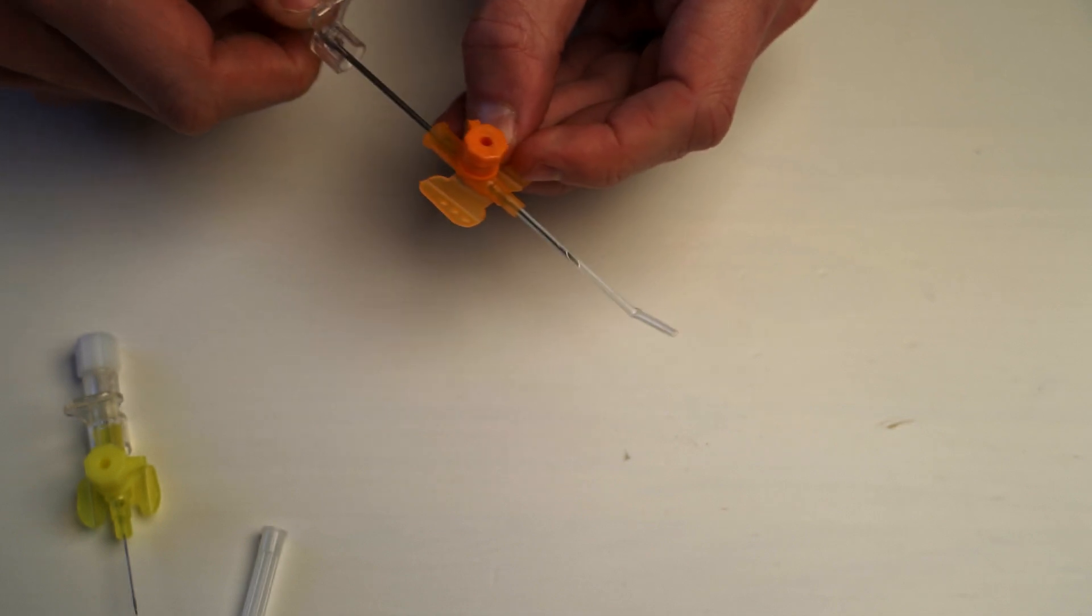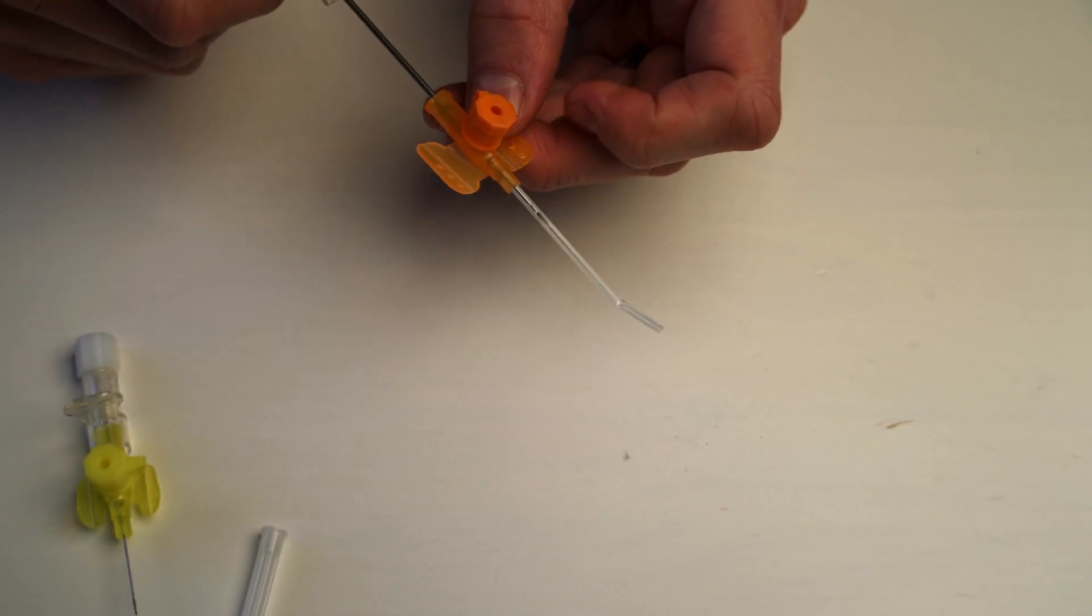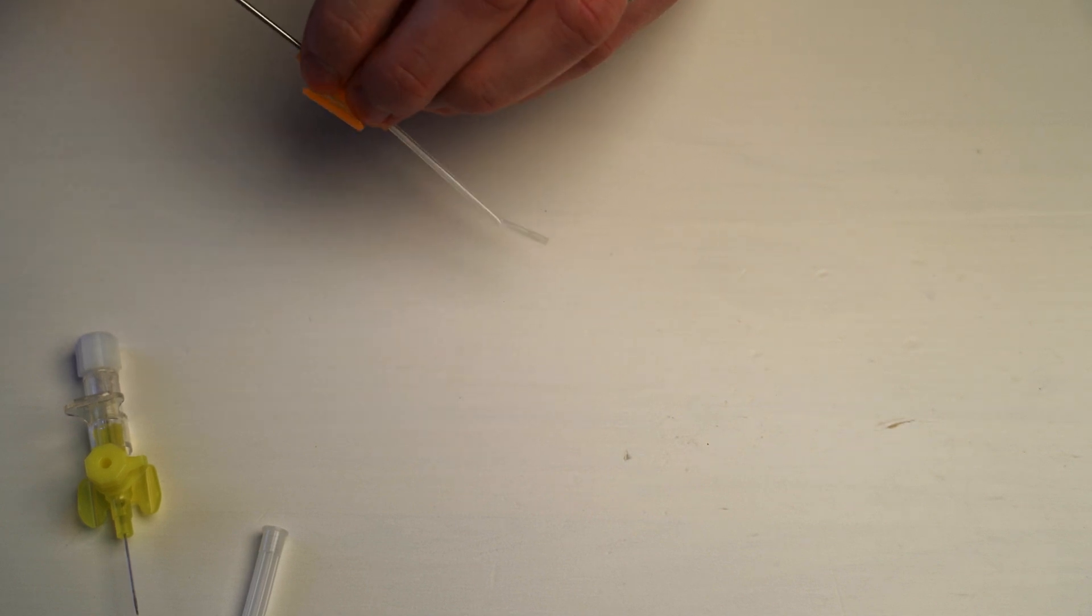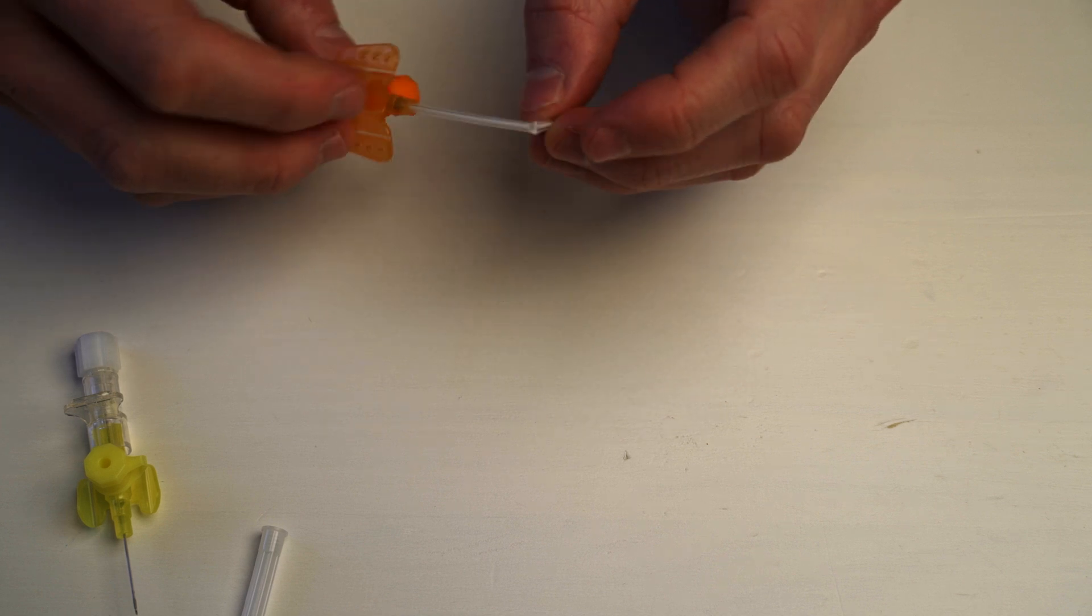If you're pulling the needle out and you want to now put it back in, you don't. You completely remove the needle and you throw the needle away. You do not advance the needle back through the cannula.